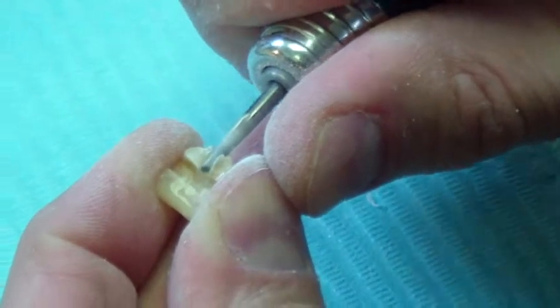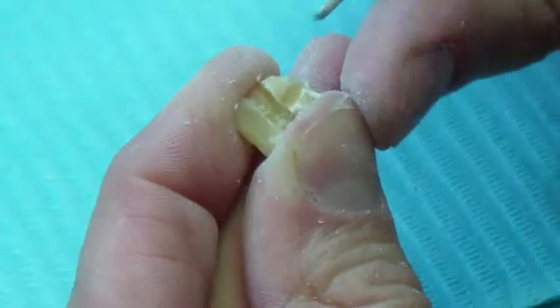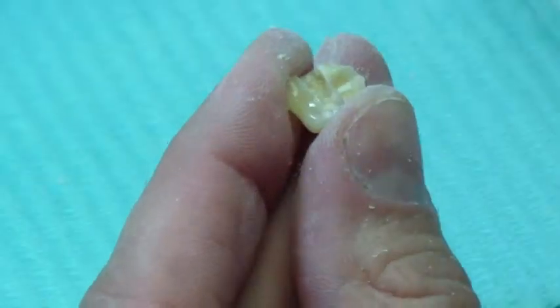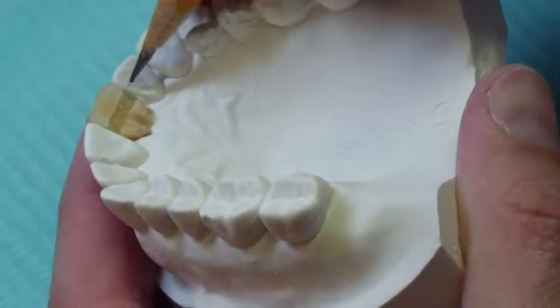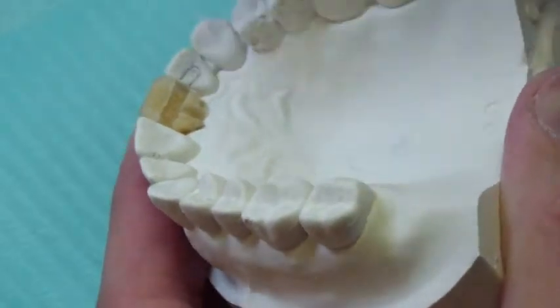Next, cut a vertical channel leading from the horizontal channel to the neck or apical end of the tooth. Place the tooth on the model and with a pencil mark the desired position of the wings on the lingual surface of the abutments.